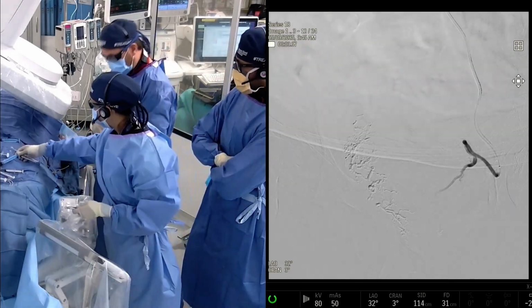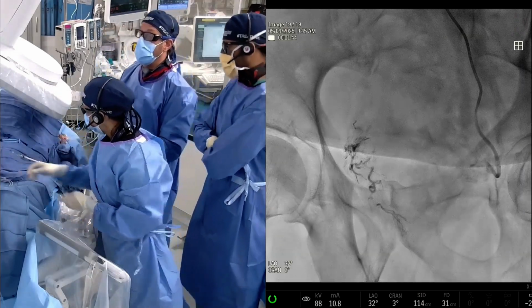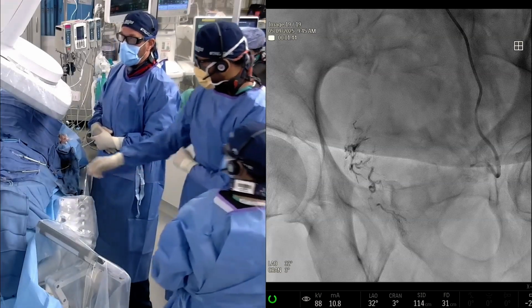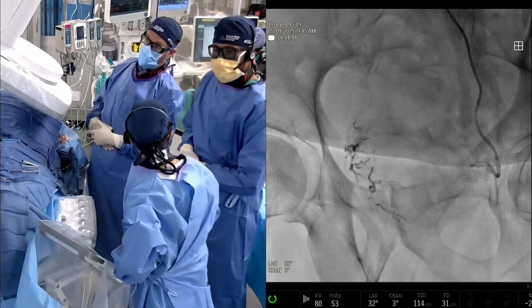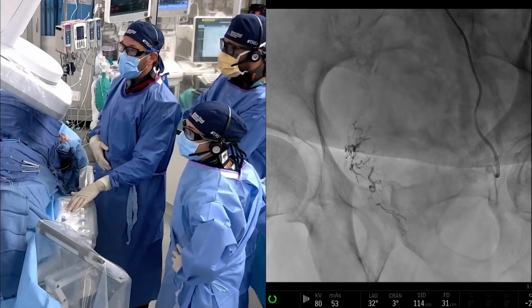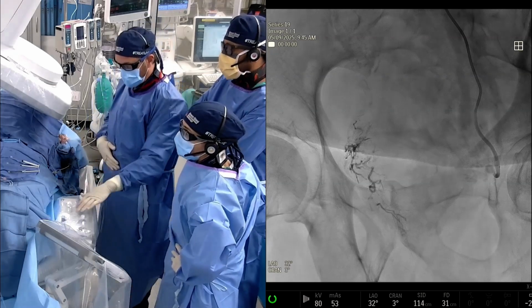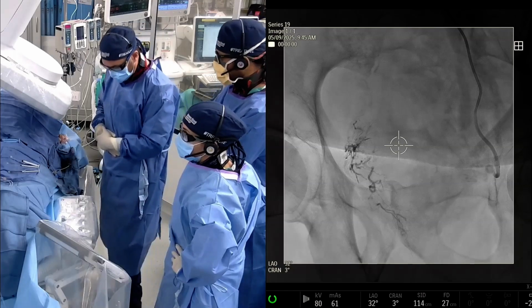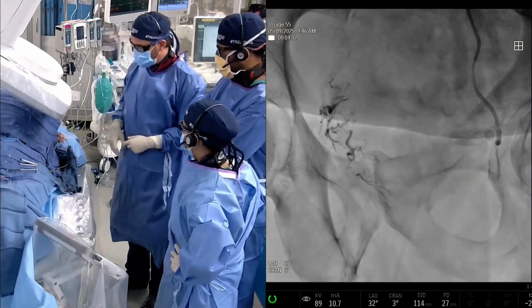But to Art's point, if we go back to the fluoro here, there's a big contrast column between the balloon and the base catheter, but the base catheter is very high up in the vessel, and so we're not gonna reflux past that. I could have flushed the catheter a little bit to differentiate the two, but I think we can see very clearly the difference between that contrast column and that balloon there at the bottom. You guys can see that pretty well? Mm-hmm. Yeah. And vice versa, if you don't have a sniper balloon catheter, you could use this technique as a way of flow occlusion type technique too, as an intermediary.